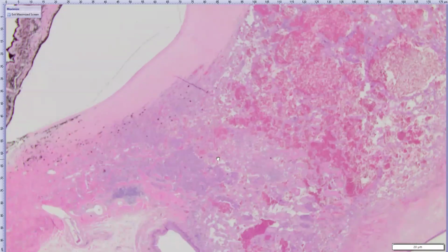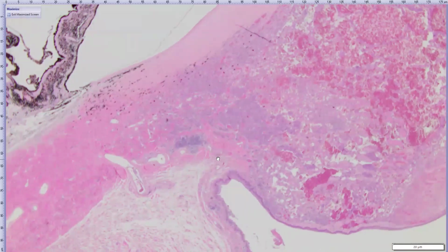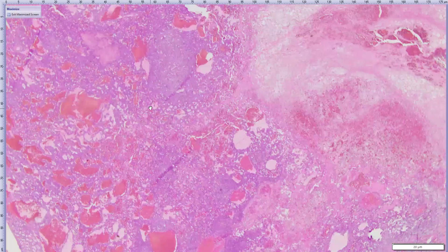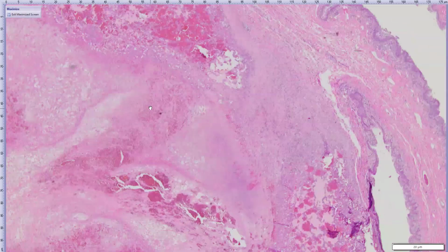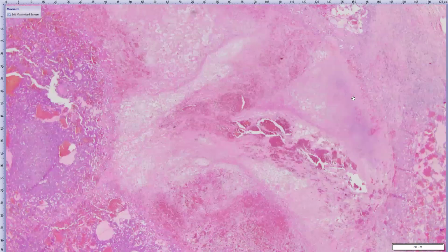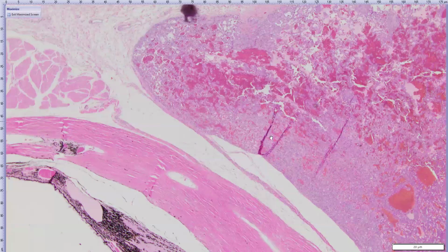Here we are. All right. So this neoplasm, and it is a neoplasm, is actually pretty well demarcated. On this side, it's mostly in the cornea, although it's extending ever so slightly into the sclera past the limbus. On the other side, it's extending into the conjunctiva. We actually have a tiny bit of third eyelid coming in here, so it's kind of bulbar side of third eyelid extension, and into the episclera, like we saw with the gross view.